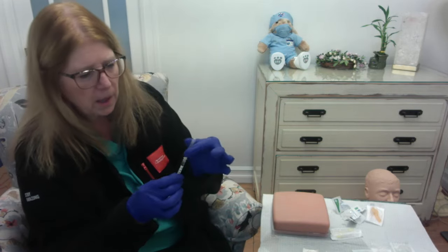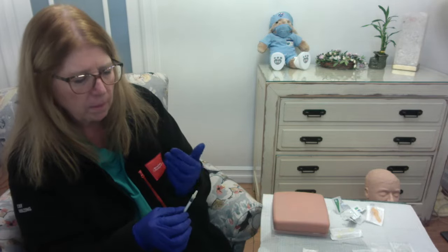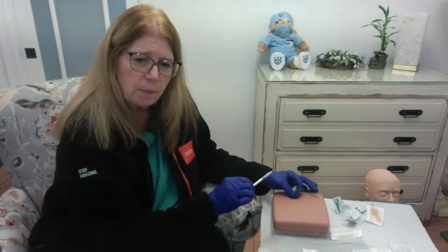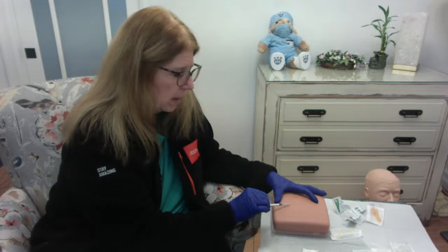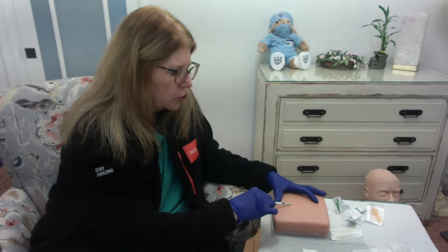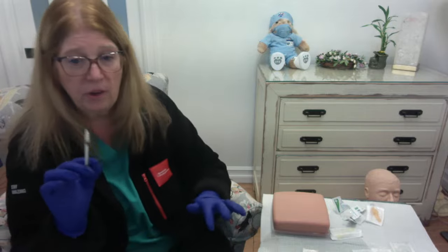I'm going to take my needle and syringe, take my cap off, and I'm going to make sure that that bevel is facing me. So the bevel is facing me, and I'm going to go in. I'm not going to pinch the skin, nor am I going to spread the skin. I'm just going to put my hands here, and I'm going to go in at about a 15-degree angle, and I'm going to inject this PPD, and then I'm going to pull my needle out, and this is going to go directly to my sharps container.